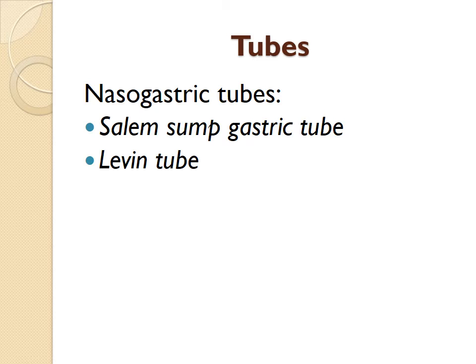With patients, for example, that have chronic vomiting or that are chronic alcoholics, that esophagus wall does weaken, and those thinned blood vessels can very quickly rupture and cause bleeding into the esophagus, into the stomach. So that third lumen will inflate a balloon around the esophagus and compress it gently so that it will be able to stop the bleeding. It's just like a pressure dressing.